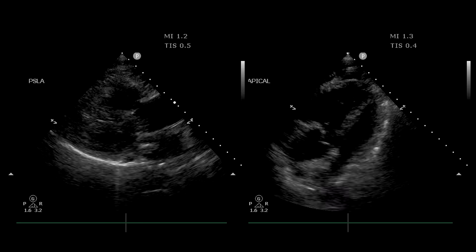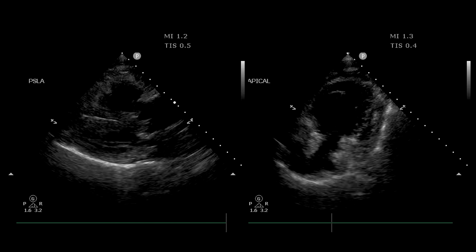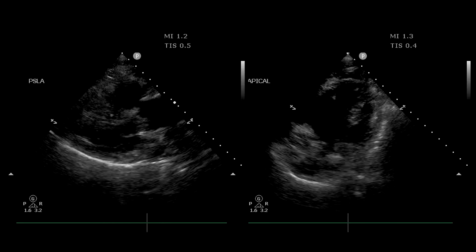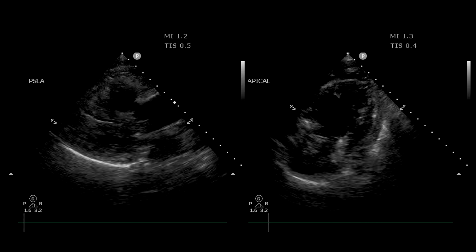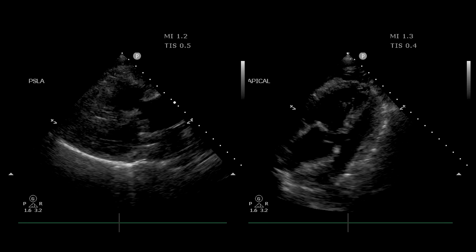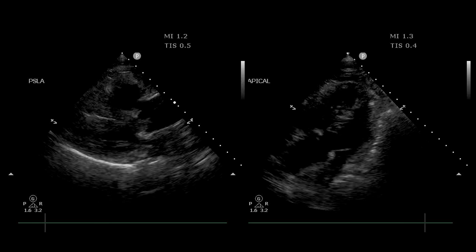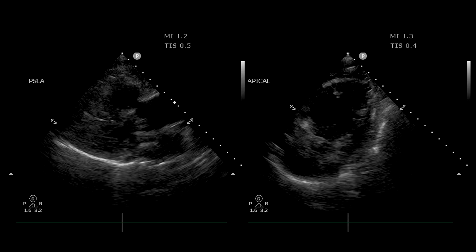You can emphasize more of the ventricle, or more of the atria. And if you aren't doing that view straight through the ventricle, straight through the valve, all the way to the apex, getting a little bit of a point at the end, you're not necessarily going to get the full left ventricle, which means you're going to have an insufficient view to get an accurate left ventricular ejection fraction assessment, right? So that's technical limitation number one.